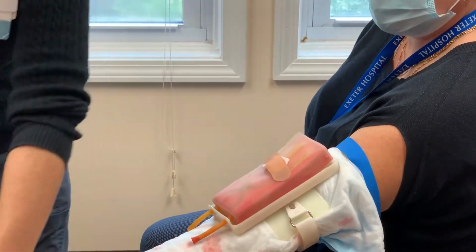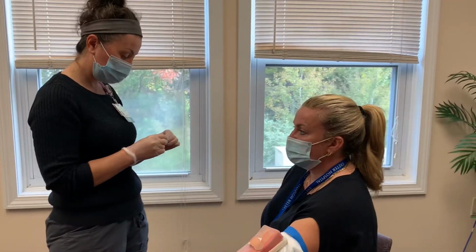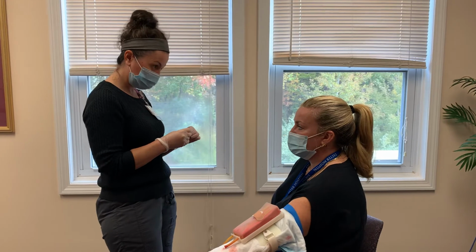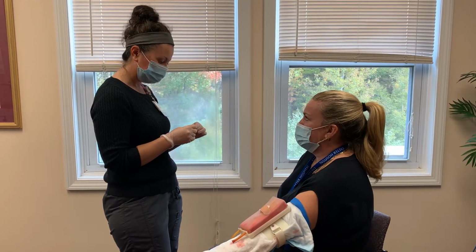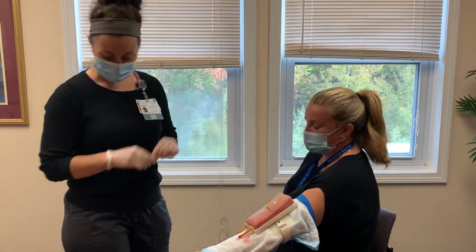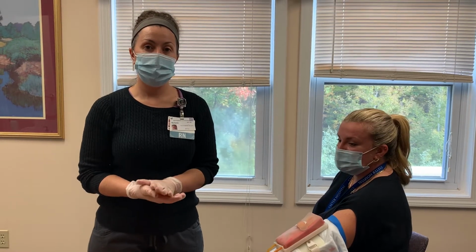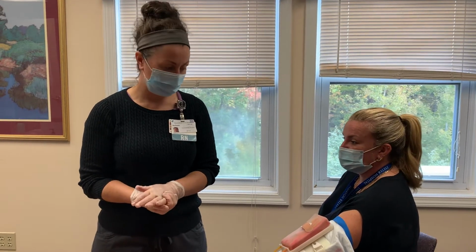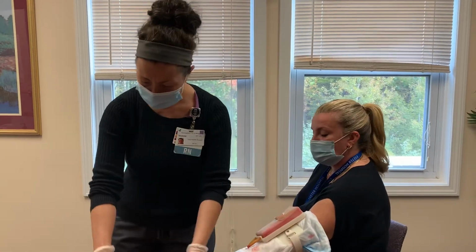All right, so I'm going to be writing it on here. And can you confirm to me your name and date of birth again, please? Rachel B. Mm-hmm. 5574. Okay. All right. And per our protocol, you have 1 hour to bring the lab specimens to the hospital or the lab.